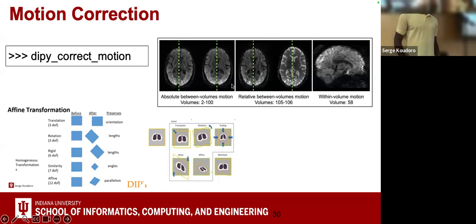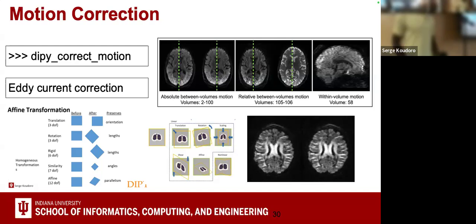So it's necessary. You need to use, for that, we use an affine registration. So I could go into detail on how you do a registration, but it's not the topic. If you have any question on how image registration works, I can explain it later. In the same topic, I put it here, but it could have been somewhere else.